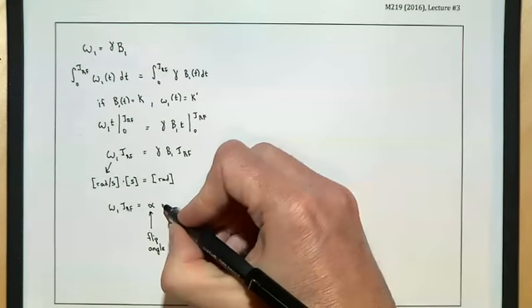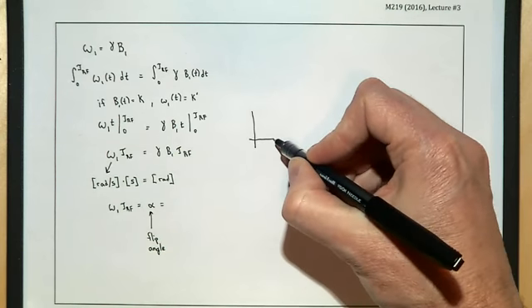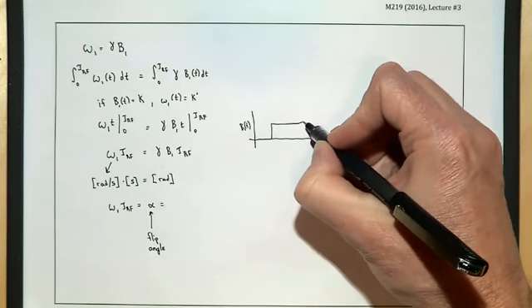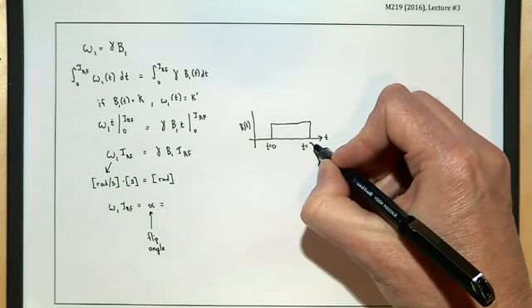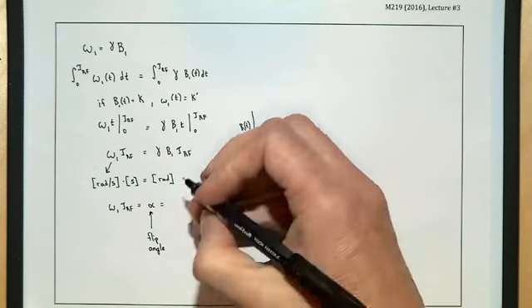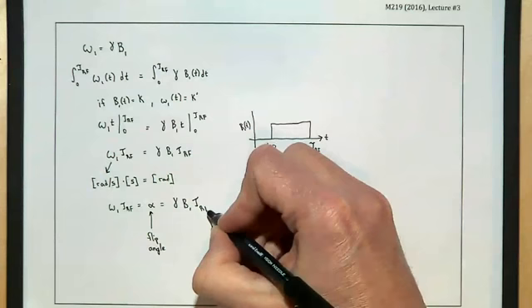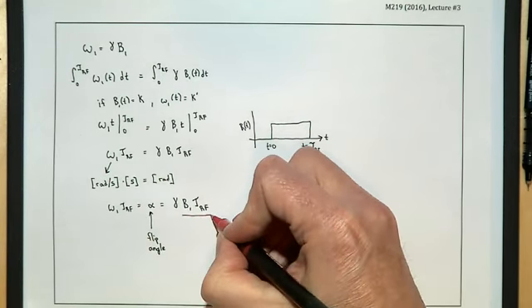And so in the simple case of a B1 pulse that's turned on and then off, you can think of it this way. This is B1 of t, this is time, and I have some B1 pulse from time t equals 0 to time t equals tau RF. Turn it on, turn it off. Nothing too exciting. And all I find is that the flip angle itself depends on gamma times B1 times tau RF. And these are the two things that we actually control, right?